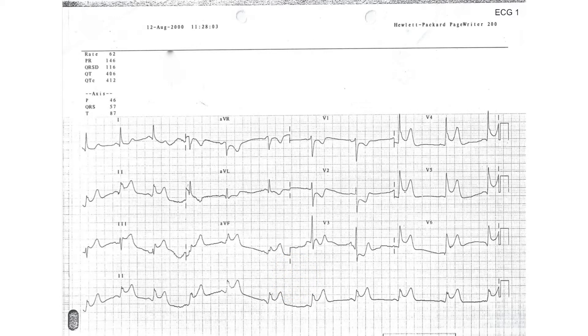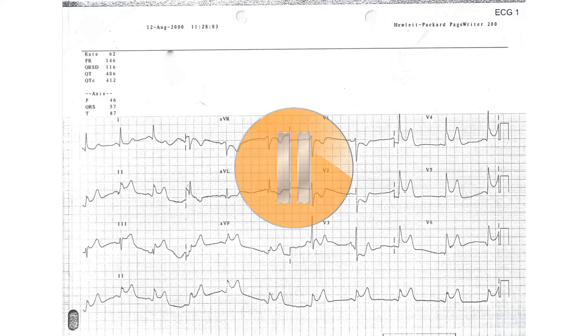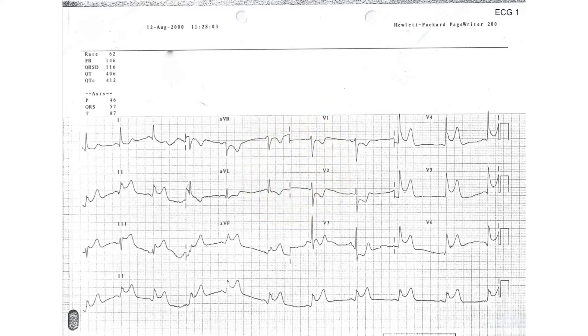This is an ECG recorded from a patient with chest pain. Pause this recording now and interpret the ECG on your own before pressing play again to hear me interpret the ECG.